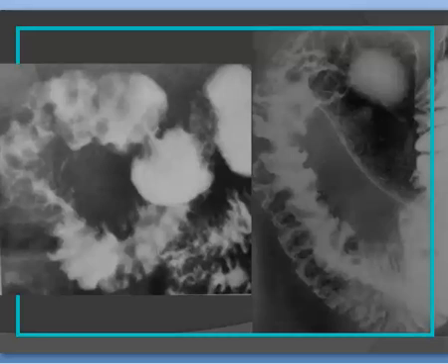This is the appearance of the thickened mucosal folds of the duodenum. Again, we should put the famous diagnosis of lymphoma on the top, then consider whether there is chronic renal disease or pancreatitis or something like that, but lymphoma should be excluded.